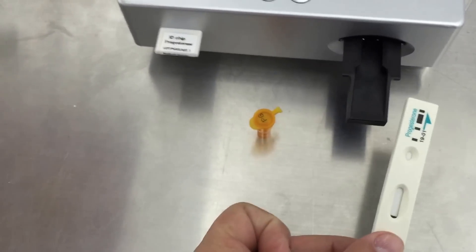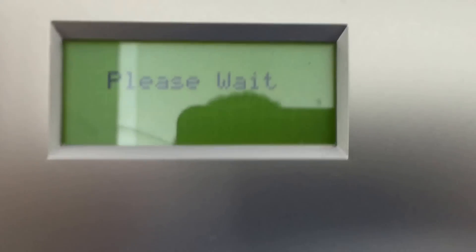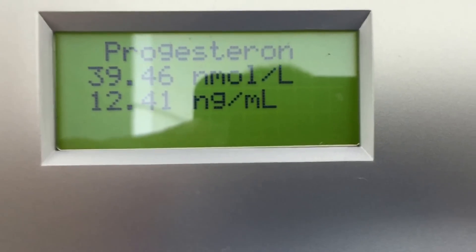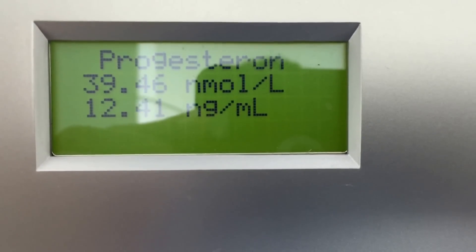After you've waited 15 minutes, you put it in the machine, you press select, and it'll start reading — it reads immediately. The result is 12.41 ng, so she's ready to be bred. Thank you.